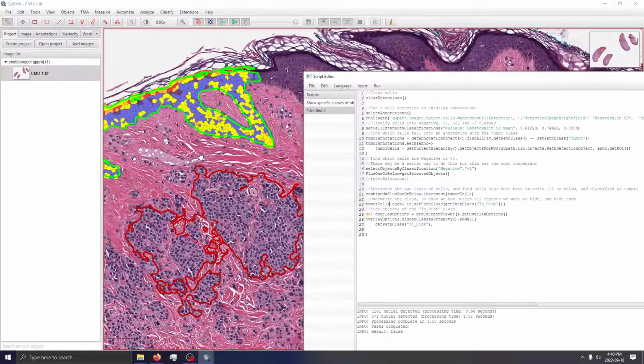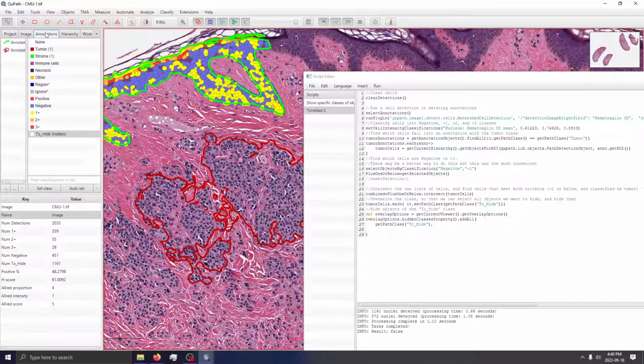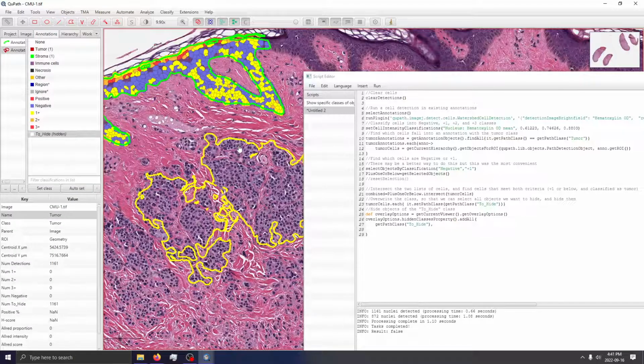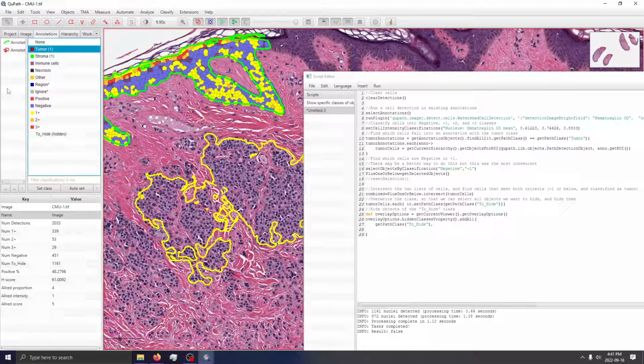Now, if you wanted to actually hide the annotation itself, same as before, you would simply select your annotation, whether it be programmatically or simply by clicking on the annotation or selecting all objects of this particular annotation class, and you can right-click hide classes in viewer, and it should be hidden.